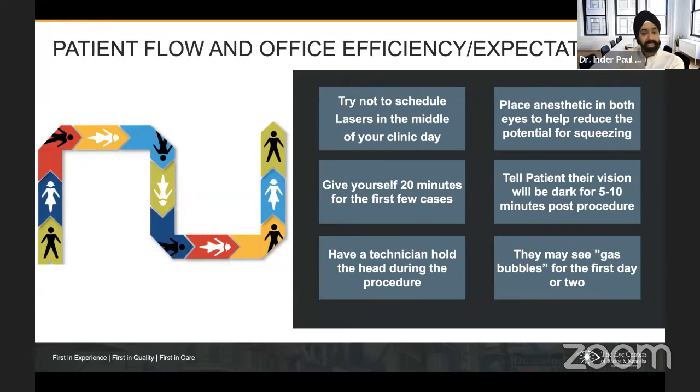And the theory again is, we think that as you're breaking up those particles and vaporizing, there's some small submicron particles that are coming around to the anterior chamber through the capsule and blocking the TM, like a pseudoexfoliation situation where they have a sudden spike. SLT works very well, by the way, if that does happen and drops don't work. So I would just be careful on those patients, but otherwise it's very rare to have a pressure spike. But I want to make sure people are aware, just to be fair and balanced, that it can happen.